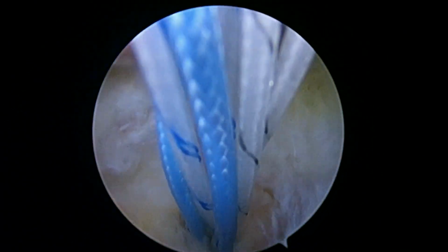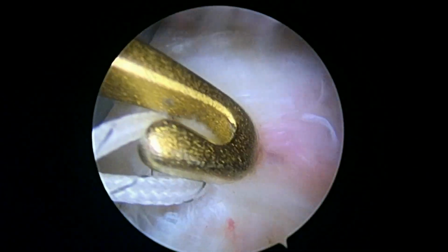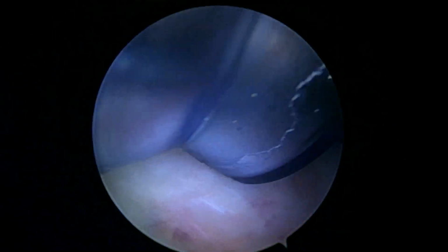Okay, so here's our triple loaded anchor in position. And now we're going to use what we call our crochet hook, just to move the sutures around a little bit. I think we're going to start with this black and white striped suture first. So we'll get this one in right here. Okay. And now we'll just start passing these sutures one at a time.